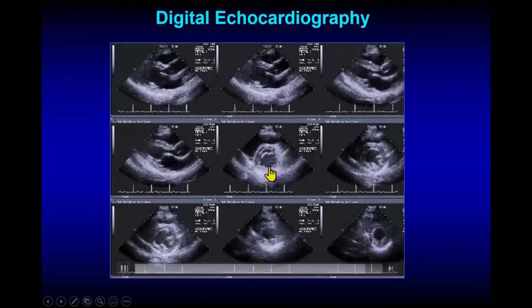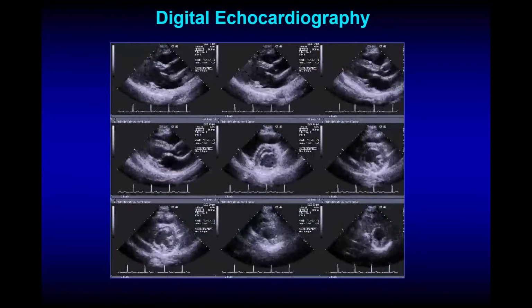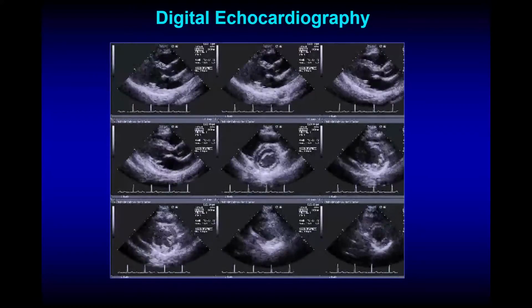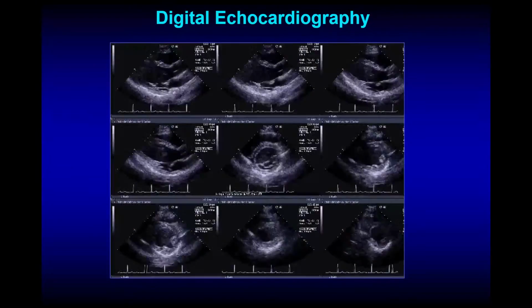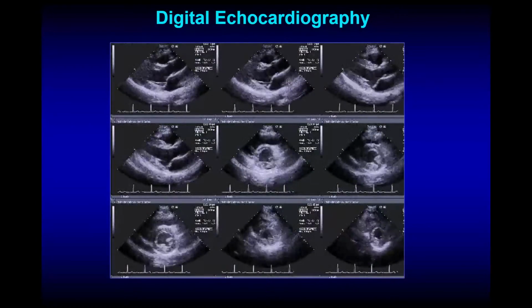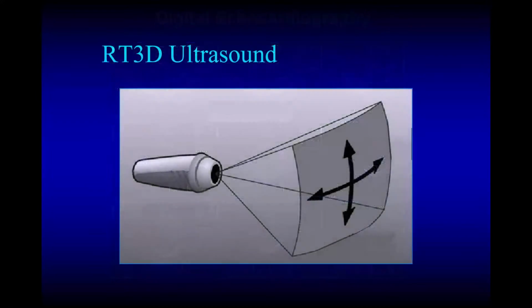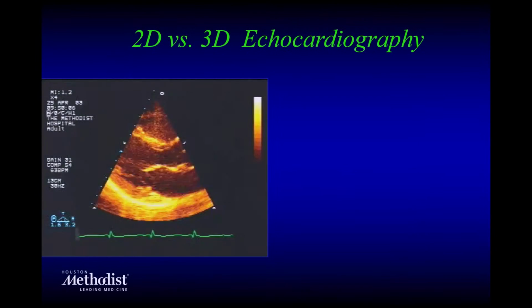Same thing for regional ventricular function assessment. Nowadays, with artificial intelligence and machine learning, some of the companies are working on displaying, actually, I want all the views that show me left ventricle, all the views that show me a certain valve. And I think we're working towards that goal so that it enhances your overall interpretation while at the same time displaying all these nice images for you to be able to interpret that.